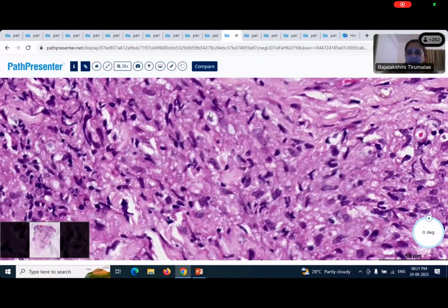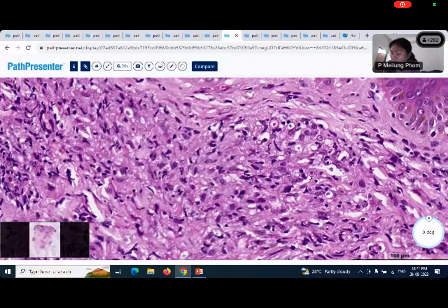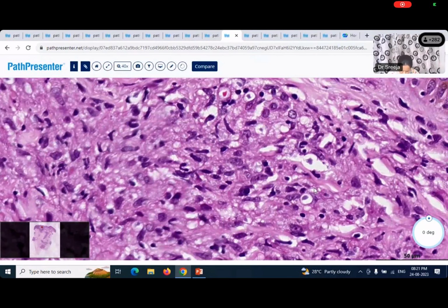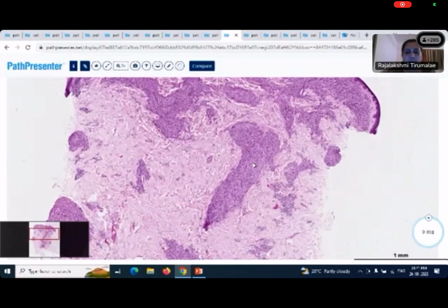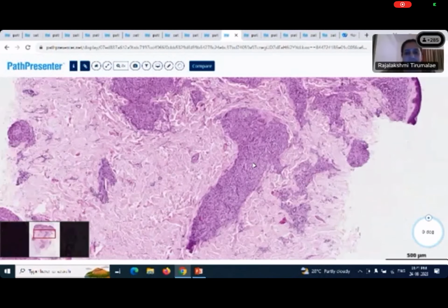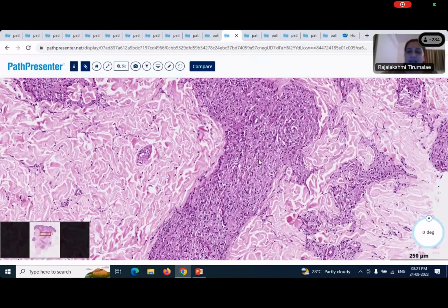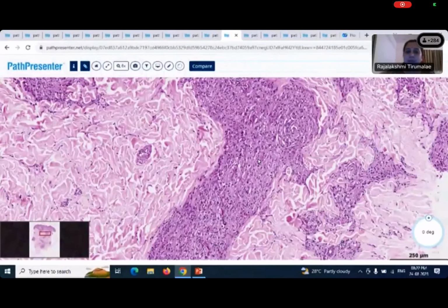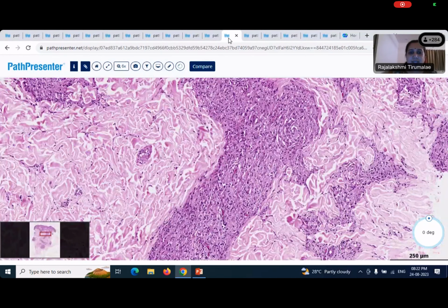What does this blue-gray cytoplasm denote? What will I find there? What special stain should I do next? What stain should I do to confirm a diagnosis of lepromatous leprosy? How would PAS help me? No, PAS would not help me. Fite stain, ma'am. So if I do a Fite stain, I'm going to see bacilli which are loaded in those cells, right? So the blue-gray cytoplasm is nothing but the bacilli or the globi in the cytoplasm, right? So even without the Fite stain, you can make it out. So the diagnosis in this case is lepromatous leprosy.